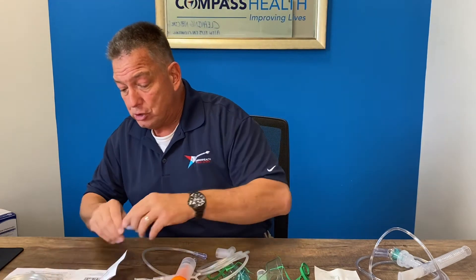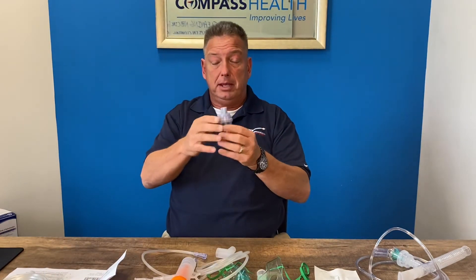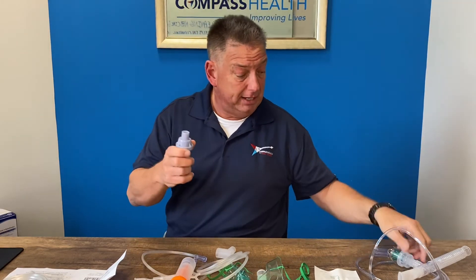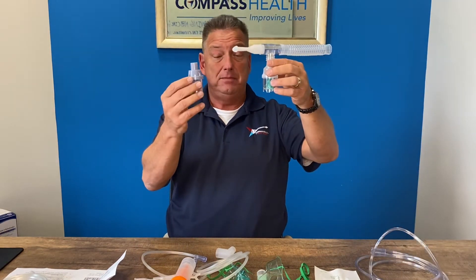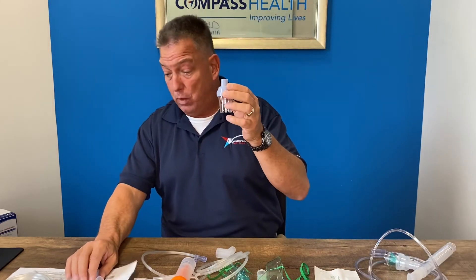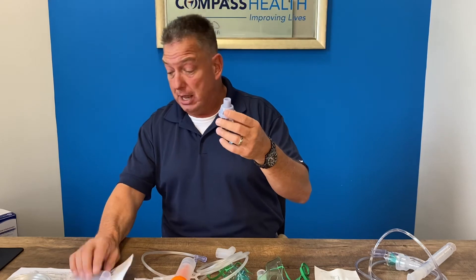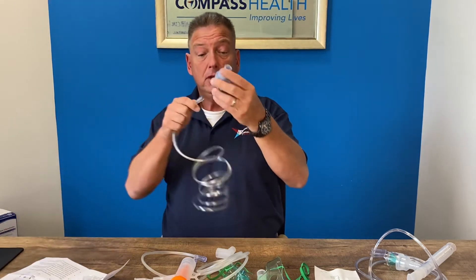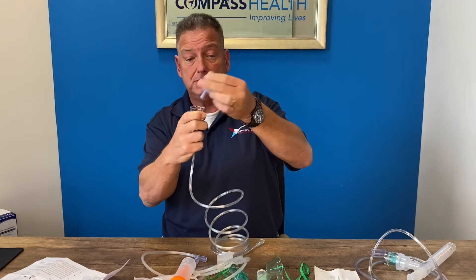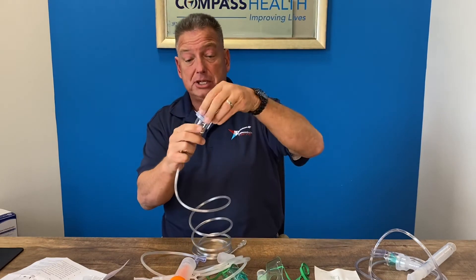This is our True Neb reusable nebulizer kit. This is also a reusable medicine cup — much closer in design to the disposable, but it will give a much quicker medication delivery time. Tubing goes on the bottom as the traditional style does. It is a one-piece design and it is dishwasher safe.